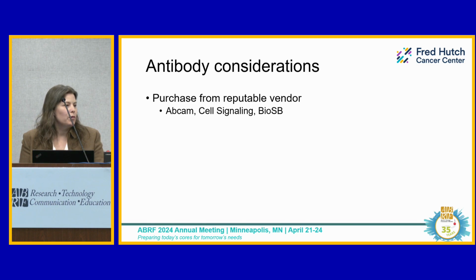I just listed a couple different vendors here. This is not exhaustive at all. Abcam is sort of a nice one. Sometimes if you've got something that's very unknown, they've at least got a money-back guarantee. If it doesn't end up working, you might be able to recoup your money and go and purchase something that works for what you need.